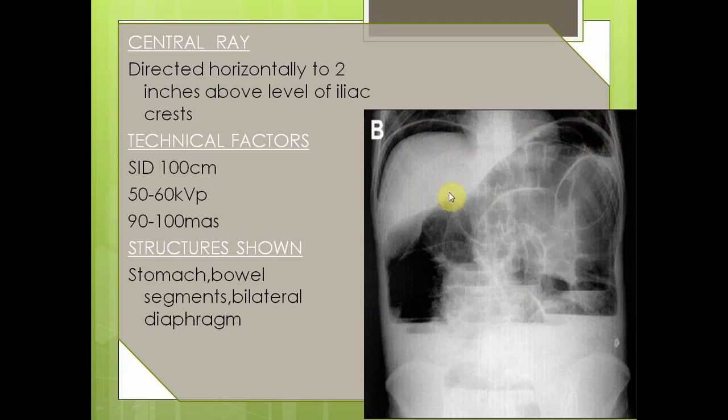Here also at the left side. So now you see this is the diaphragm. Below that, if you look at the dark area, you can see this is the air, this is the liver, and this means pneumoperitoneum. It might be suspected perforation or some other pathology. That's the reason. On the left side, here also there is some air level. Maybe it is inside the stomach, maybe outside the stomach, we cannot make out. So that's why the right side is always very important to include, even in the decubitus view.